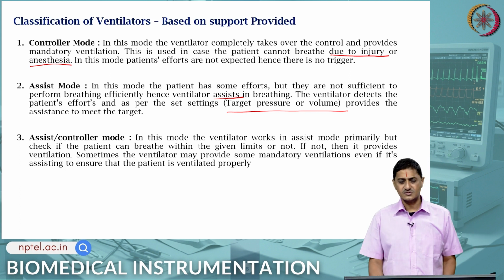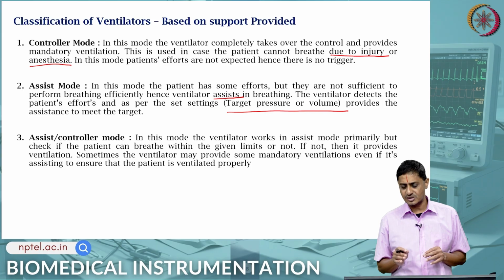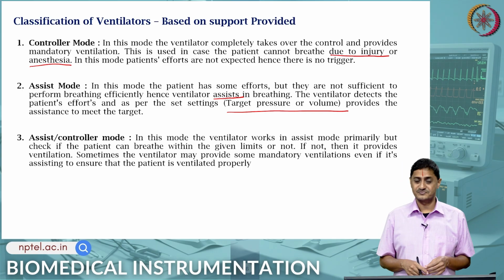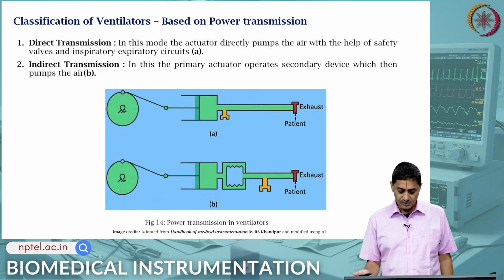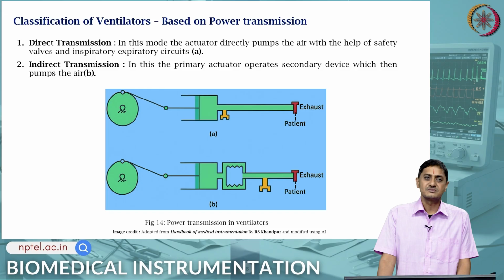Right. So, first is controller mode, in which there is complete takeover. Second is assist mode. Remember, who is the assistant? The ventilator is the assistant. Okay. Third is assist control mode, a hybrid between the two. Another way to classify is based on power transmission.